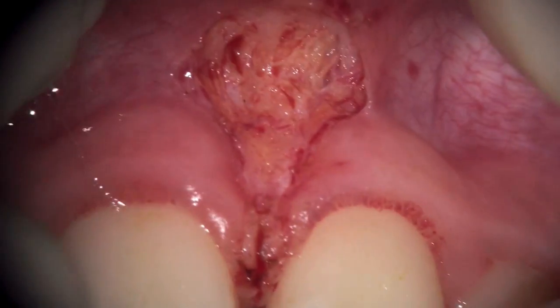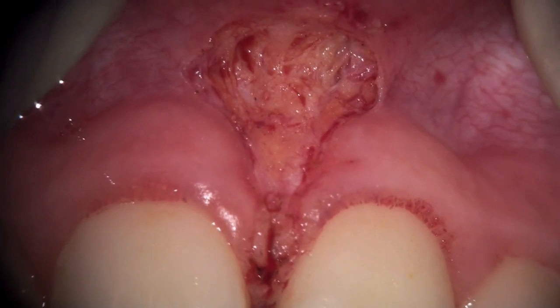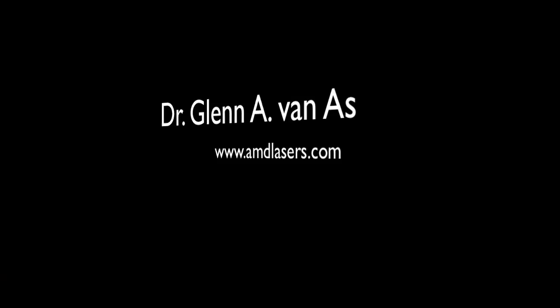No sutures are used, and we'll see the patient again in 7 to 10 days to re-evaluate the healing. I want to take this chance to thank you and AMD Lasers.